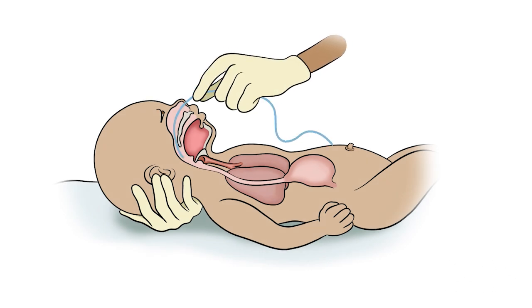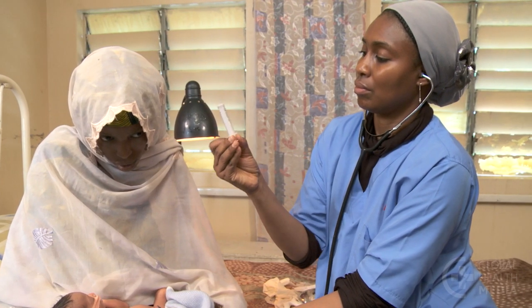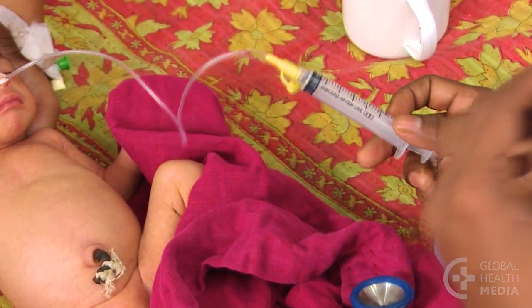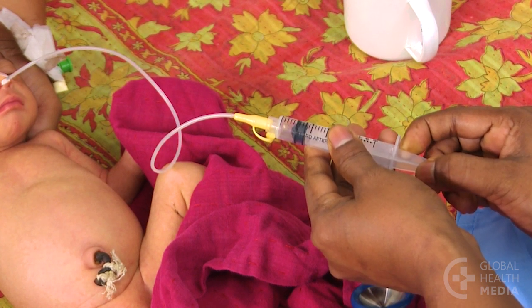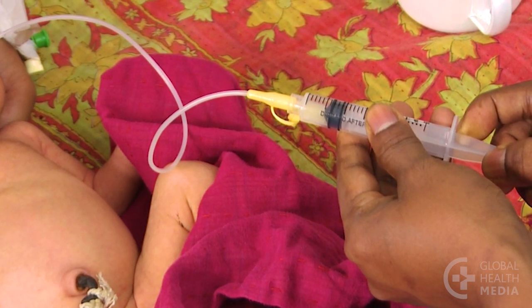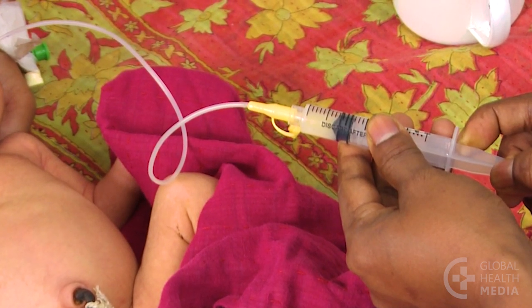Very rarely the tube may try to go into the trachea leading to the lungs. This is rare but serious. A feeding that goes into the lungs can possibly be fatal. Always check for correct placement. Connect the syringe to the tube. Pull back on the syringe and look for small amounts of digested milk or gastric fluid in the tube. If there is no fluid in the tube, remove it and repeat the procedure.